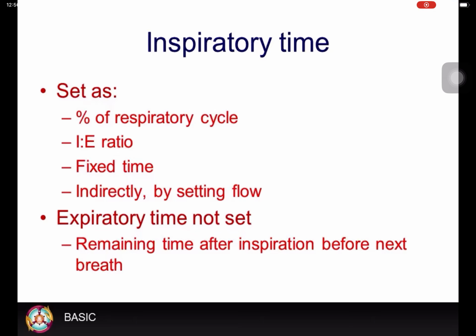Inspiratory time can be set as a percentage of the respiratory cycle or as a ratio of inspiration to expiration, the so-called IE ratio. Alternatively, it may be set as an absolute or fixed time or indirectly by setting flow. Note that on most ventilators, the expiratory time is not set directly, but is merely the remaining time after inspiration before the next breath.